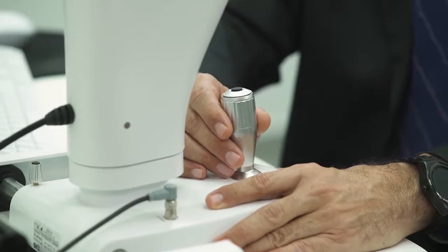At the moment, what we'll do is go from slightly out of focus, into focus, and then out of focus again. The system will take 25 frames a second, and it will choose automatically the frame that is the most focused. That is how it will work. So we don't have to think about whether we're in focus or not in focus. The system knows how to do it. It uses a lot of artificial intelligence, and it is able to capture the image that will be most representative. In the beginning, we suggest taking 3 images of each eye.